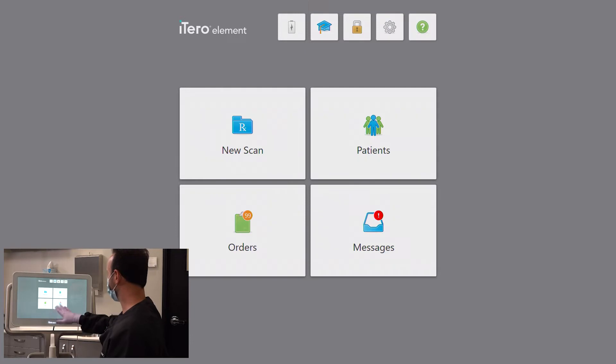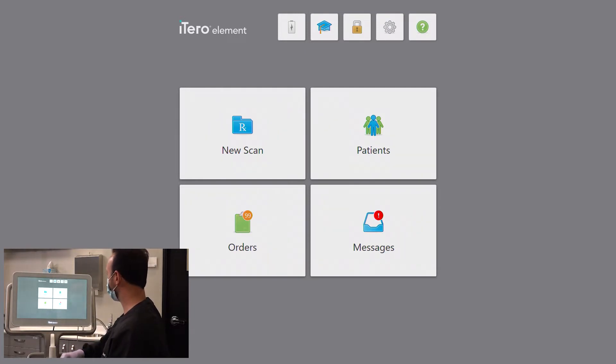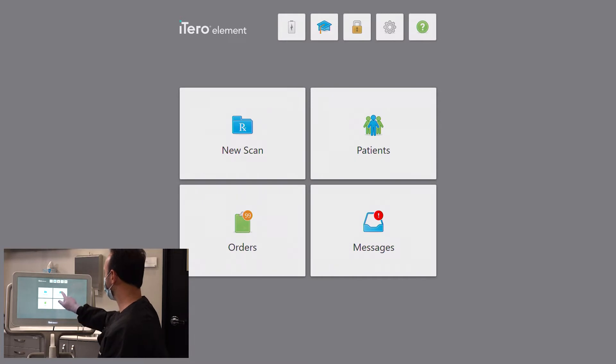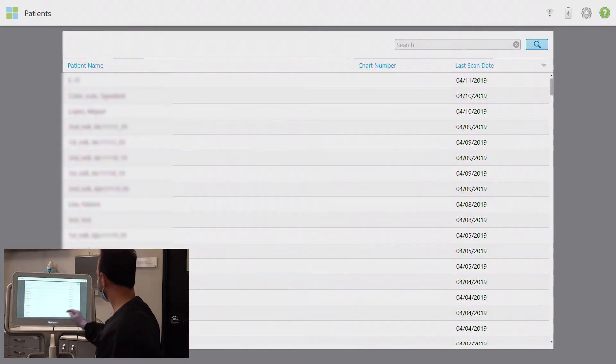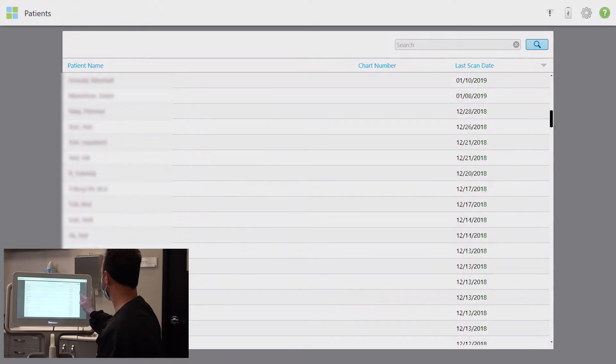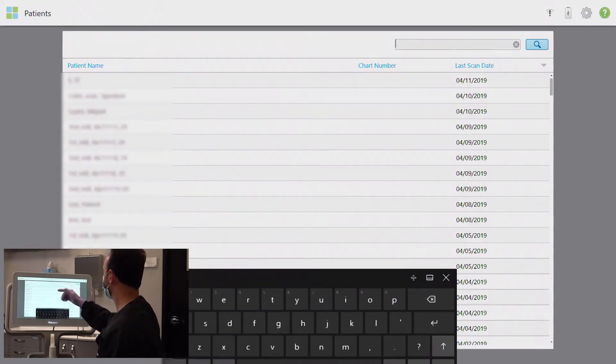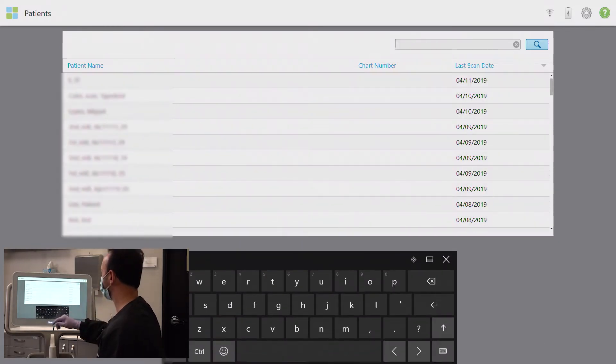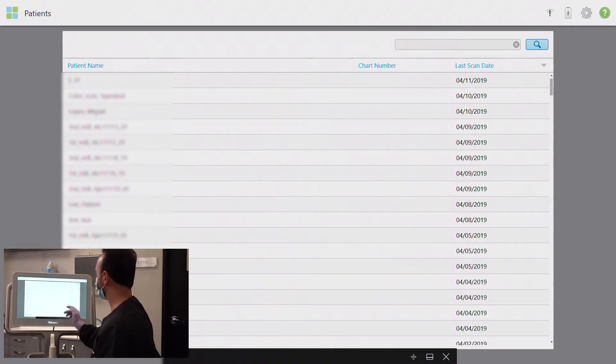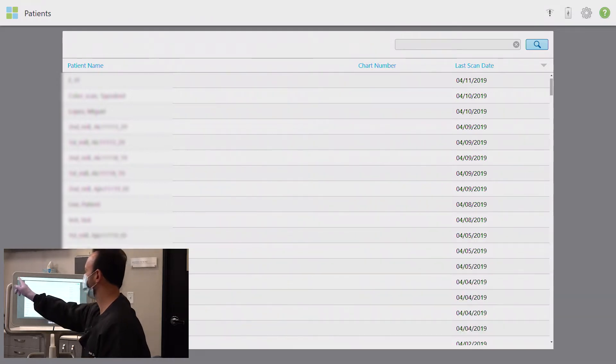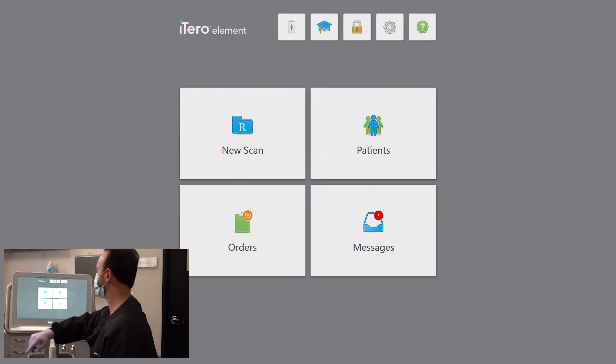So if the scan is going to be taken on an existing patient of record in your iTero system, click on the patient's menu box and then either scroll through the patient list or click on the search bar and type the patient's name to find them. If they don't happen to be listed here and you need to back out of this menu and enter them manually for the first time, simply click on the small menu icon in the upper left-hand corner of the screen and return to the main menu.